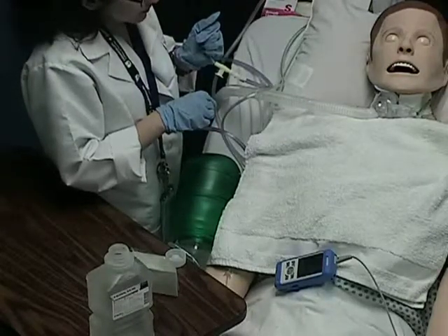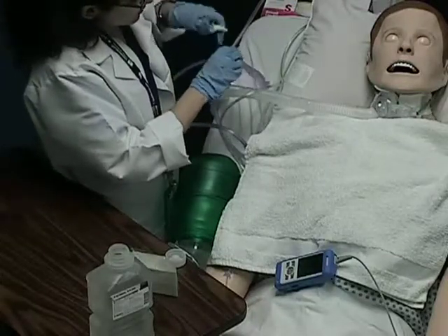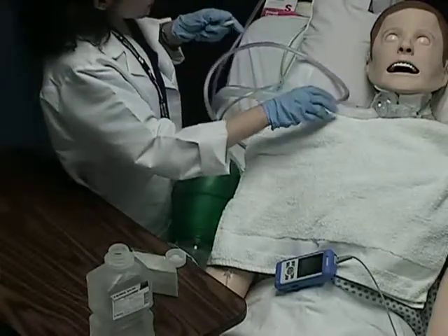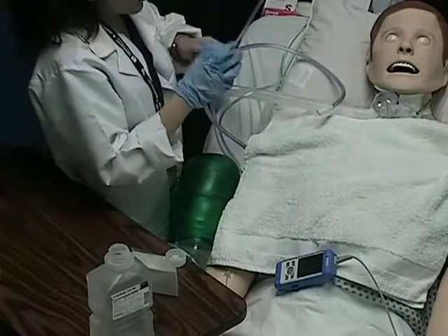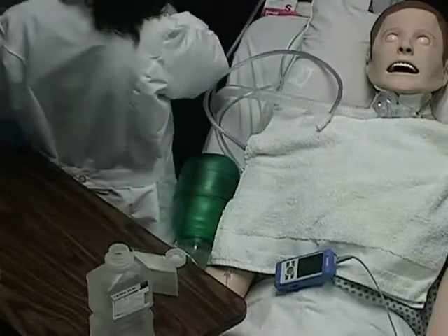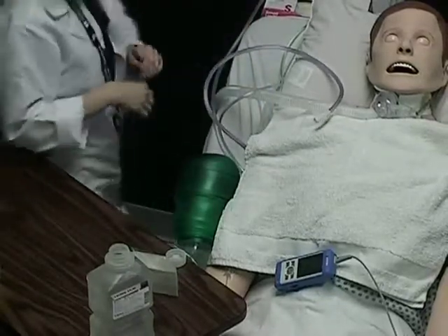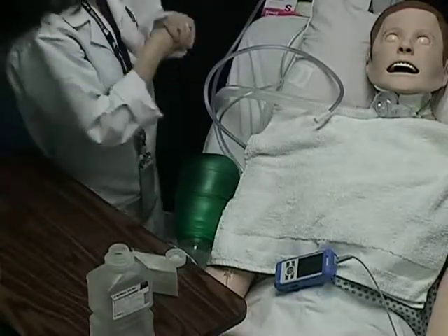To complete your procedure, disconnect the catheter. Roll catheter around fingers. Pull off gloves so catheter remains inside, and discard appropriately. Perform hand hygiene and turn off suction.